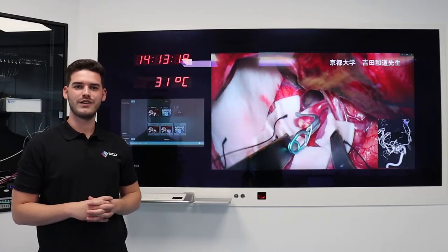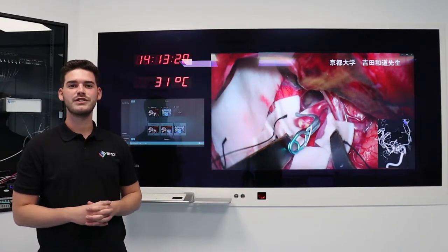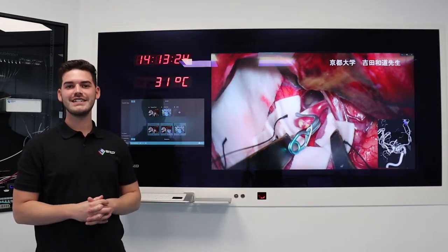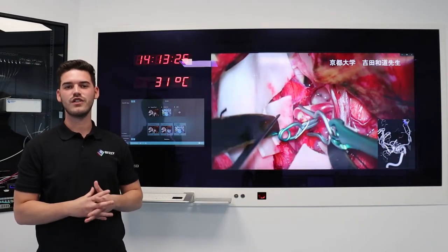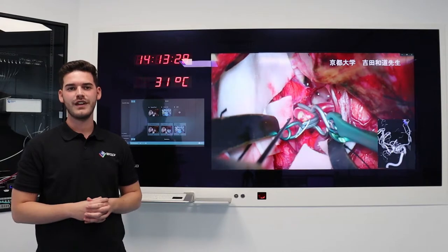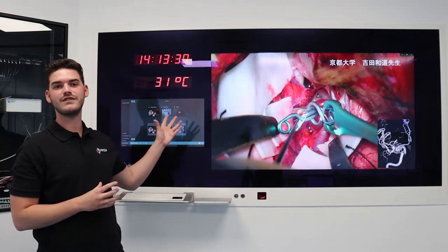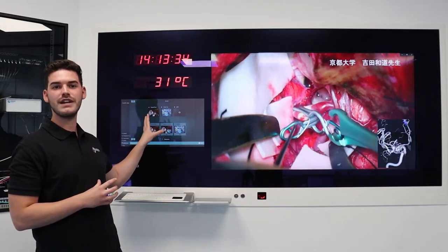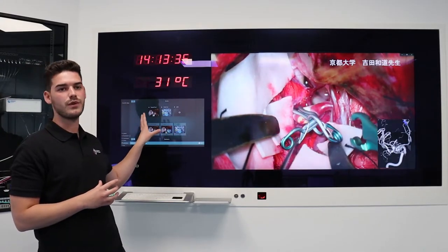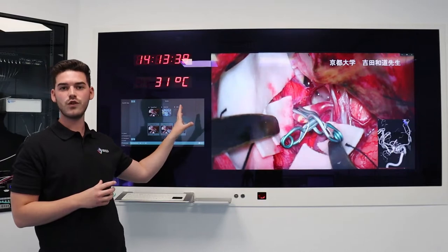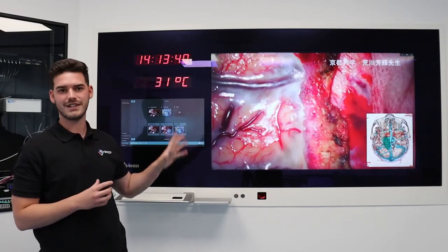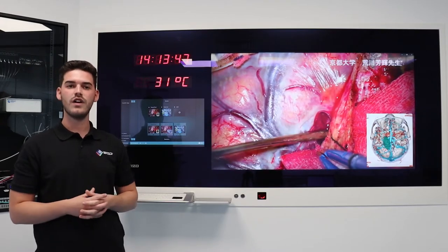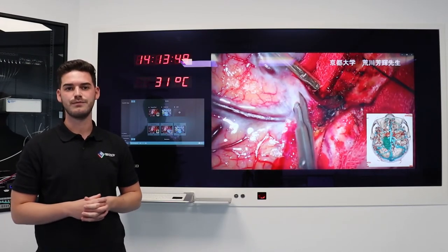Here we have our surgical panel. With two integrated monitors as well as built-in IT and video management components, this is a digital image viewing system designed for use in the operating room. This here is our SB2 24 58 4K. The smaller 24-inch touch display is used for control of our video management software, whereas the larger 58-inch 4K display uses a HIS or PAC station. The units are fully customisable — on-wall, in-wall — a size to suit any operating room.